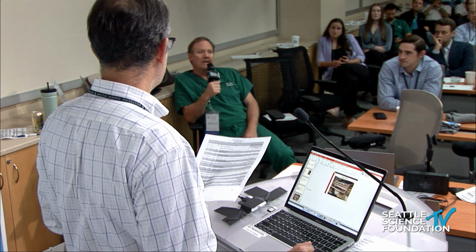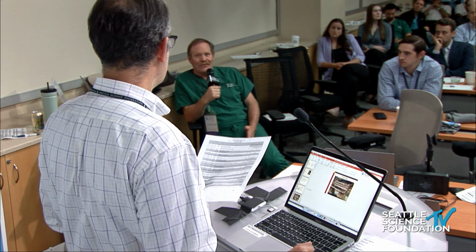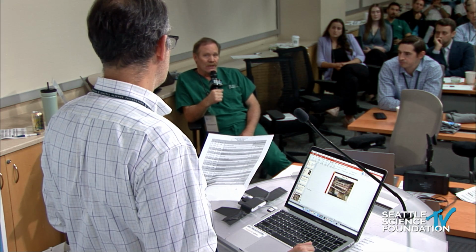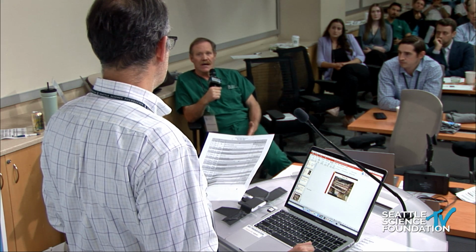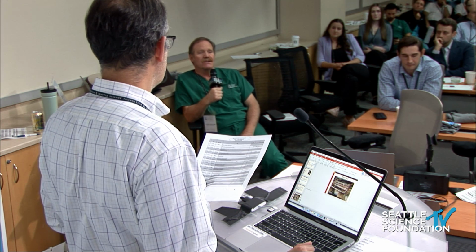I put Prestige in people. I call it the old guy disc. And I think it has even less mobility when it comes to a hard stop from that ball and trough. But it's the mobilization, it's the decompression, and you're absolutely right.